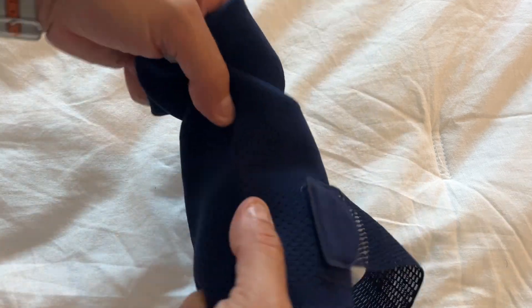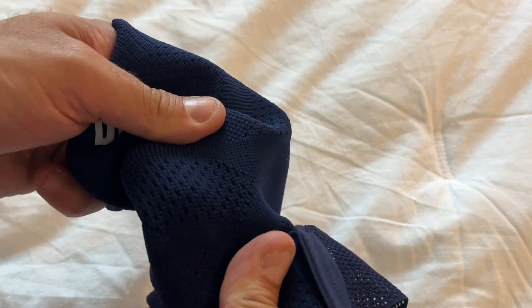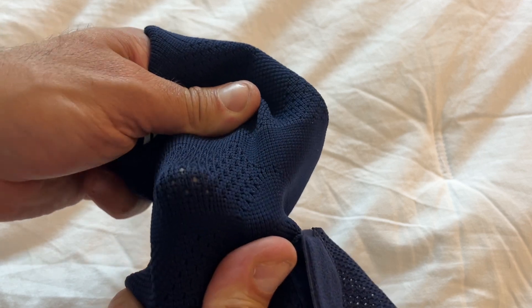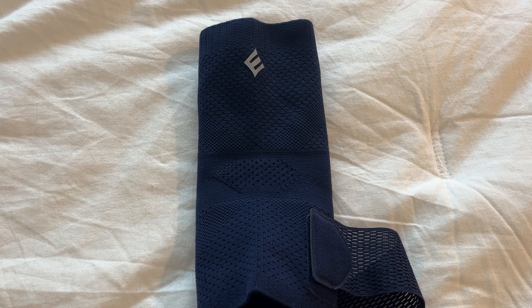You can see here too, right where your leg or your foot is going to bend a little bit, you've got more of those micro holes really allowing breathability and comfort. Awesome design here.